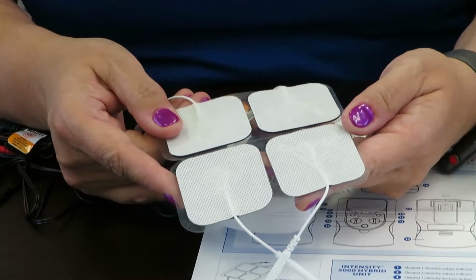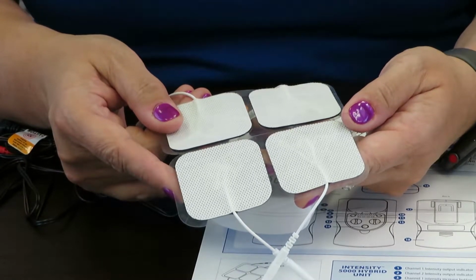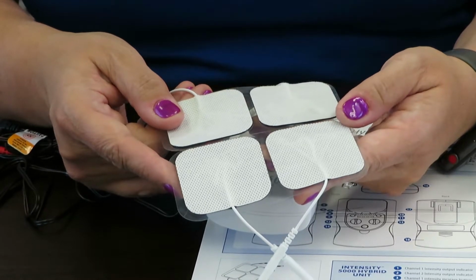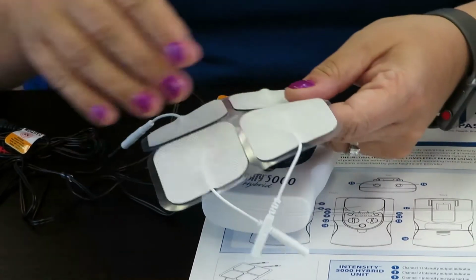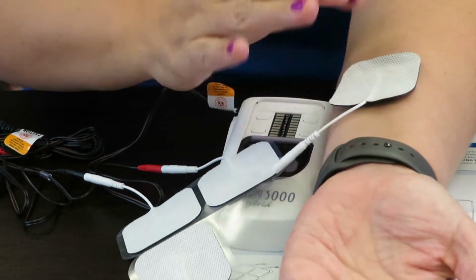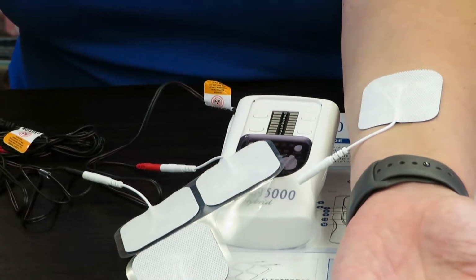Let's discuss the electrodes. These are disposable and should be replaced before they start to lose their adhesive nature. Before applying the electrodes to your skin, you should wash your skin surface to remove excess oil, which will build up on the electrode pads and reduce the life of use. Then, you'll remove the electrodes and apply them firmly to the area being stimulated.